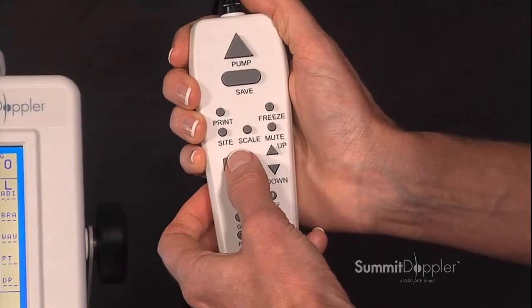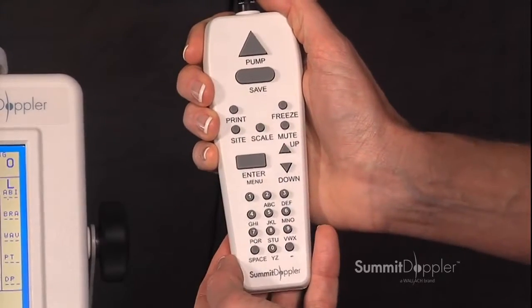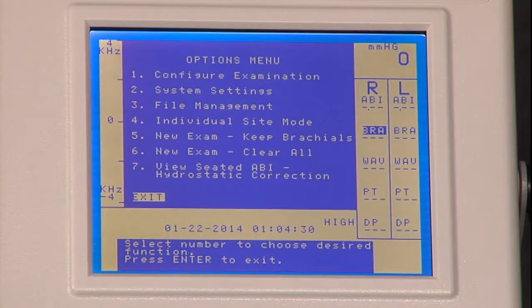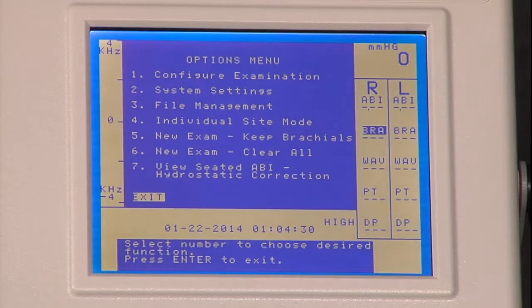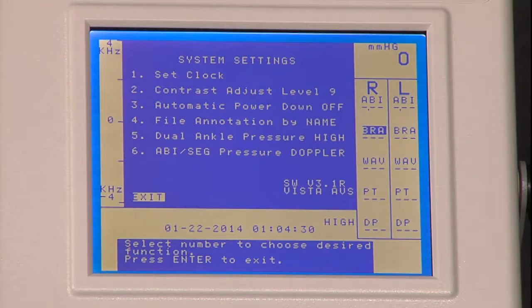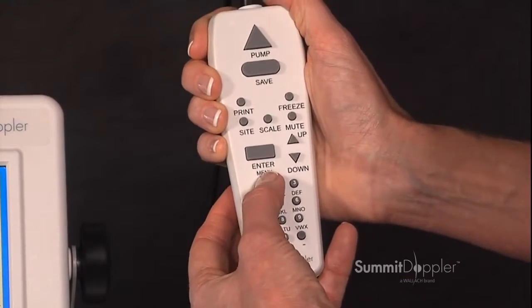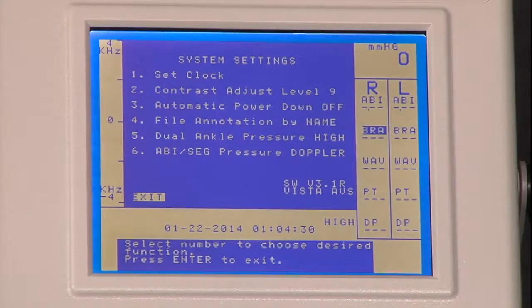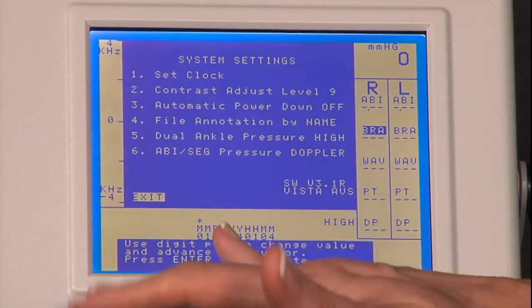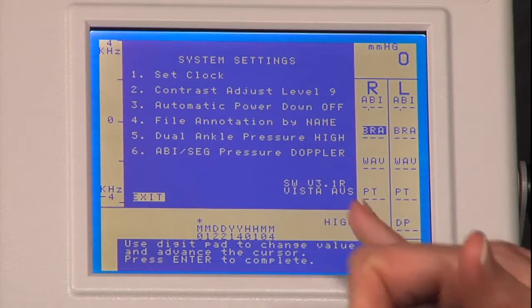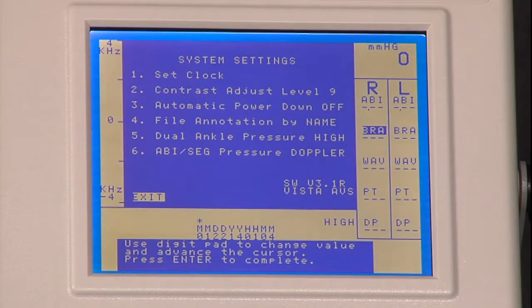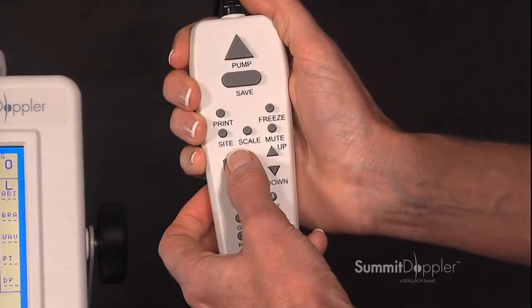Pressing the enter menu key on your hand control twice will take you back to the options menu. Pressing number two for system settings — number one would set your clock. Pressing number one to set the clock will bring up the month, day, year, hour, and minutes to be entered. Pressing the enter menu.